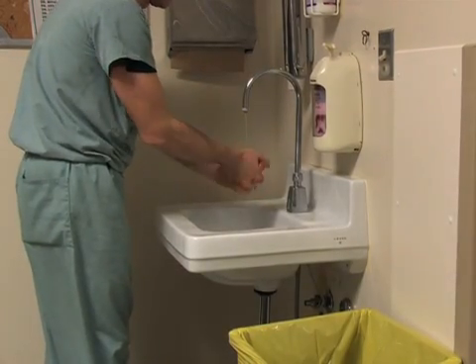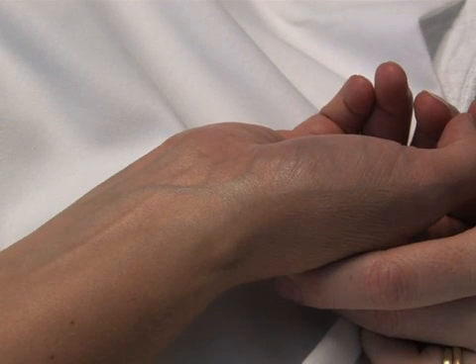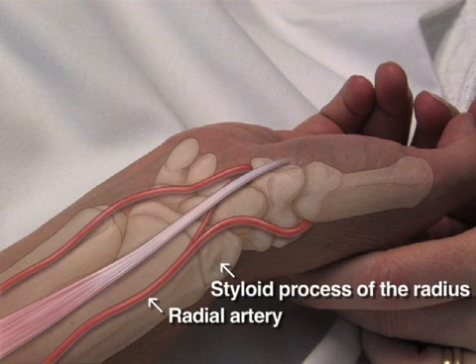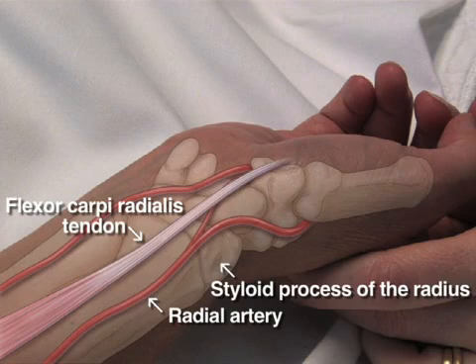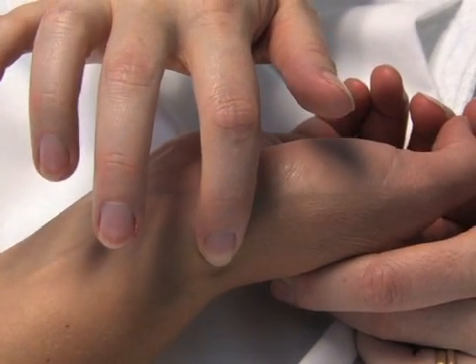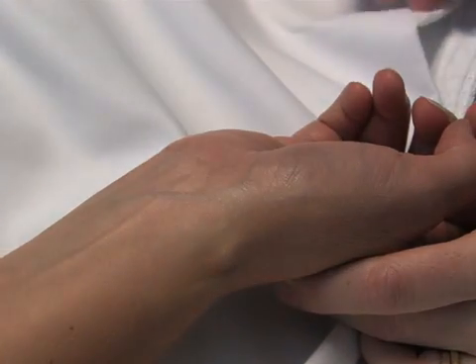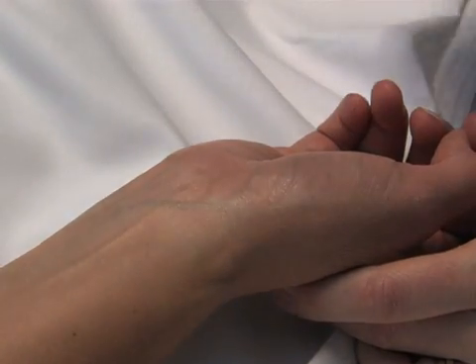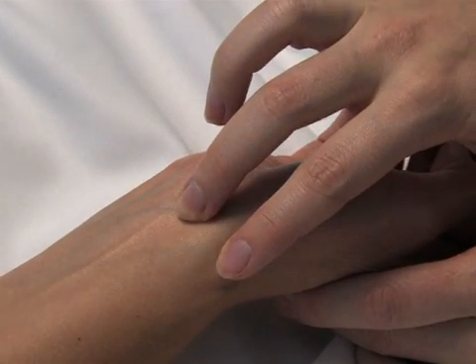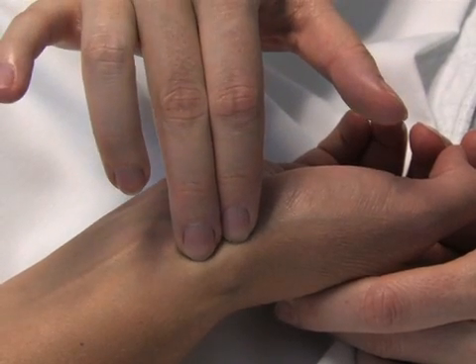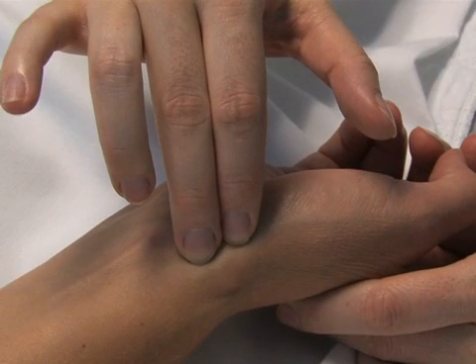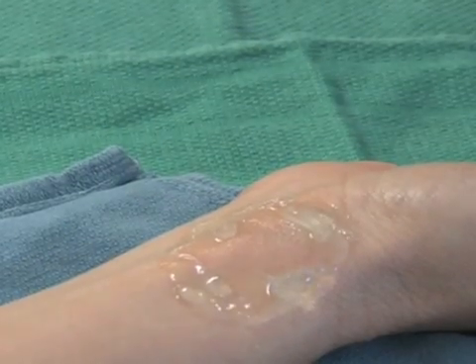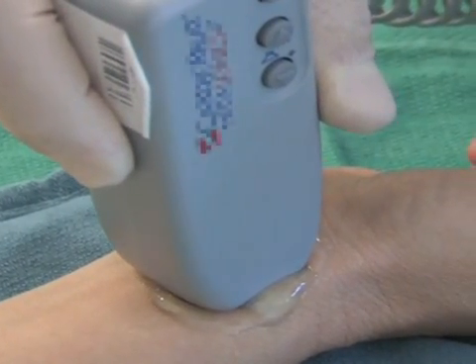Wash your hands according to good standards prior to examining the patient. Extend the patient's wrist to bring the radial artery close to a more superficial position. The radial artery is located between the styloid process of the radius and the flexor carpi radialis tendon. First, palpate the styloid process of the radius. Next, palpate the flexor carpi radialis tendon located medial to the styloid process. Now locate the artery between these two points. The artery may be difficult to palpate, for example, in the presence of overlying edema or vasospasm.